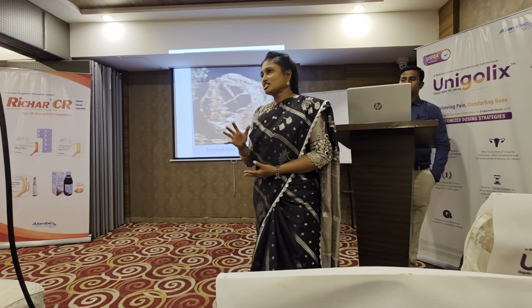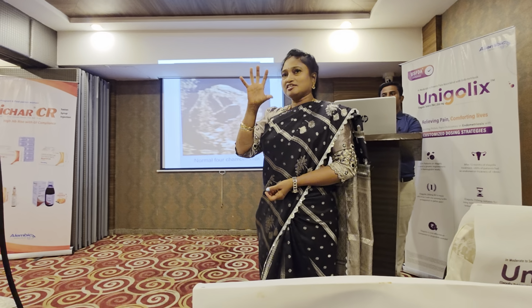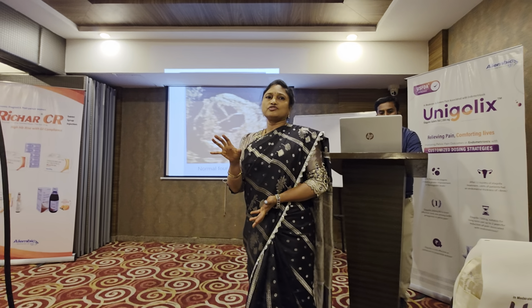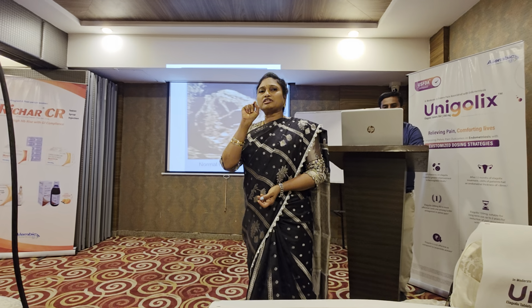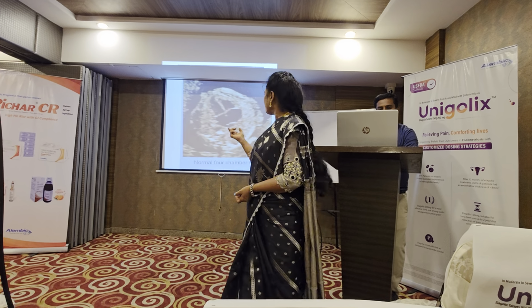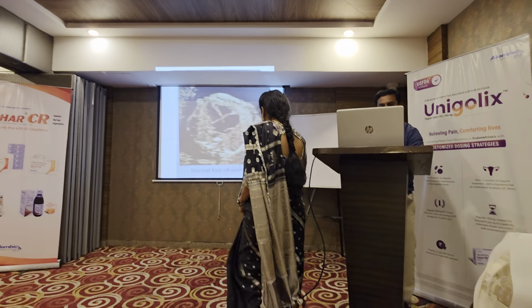In the heart, I am not a specialist regarding fetal echo. I just do all the 6 views. If everything is fine with the 6 views, I am happy. I'll just go on. If there's anything a little bit wrong in any of the 6 views, I refer to a radiologist. Next one. So previous one first.